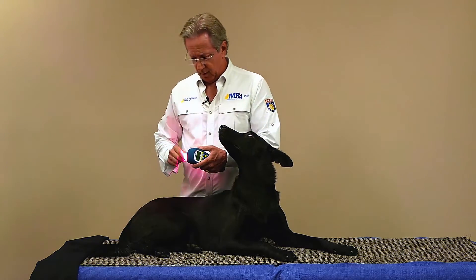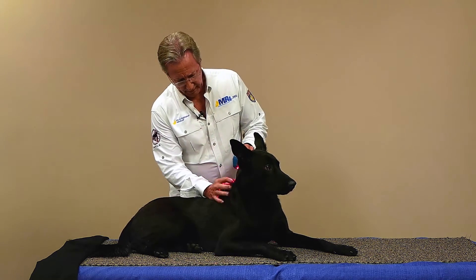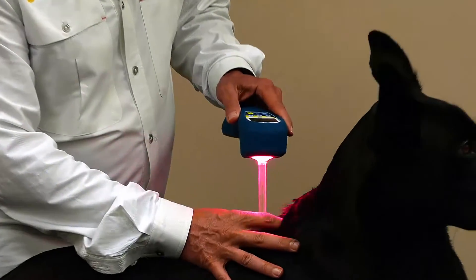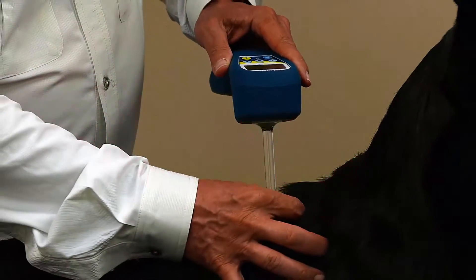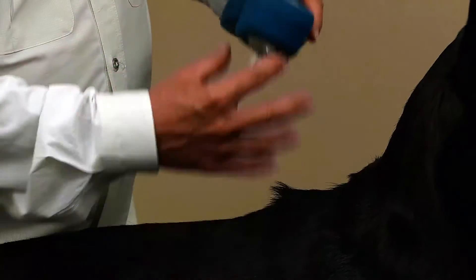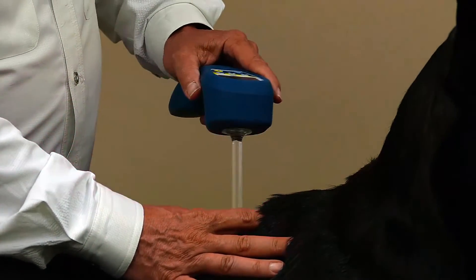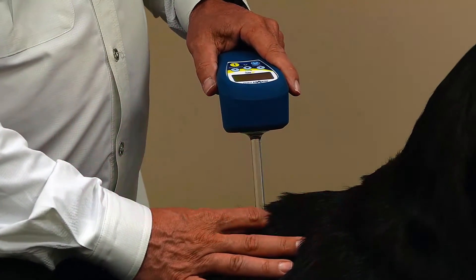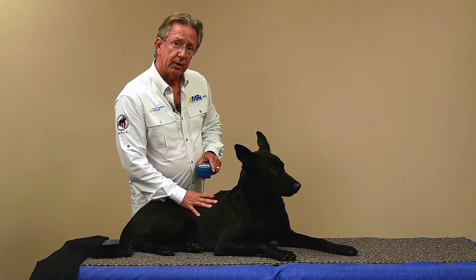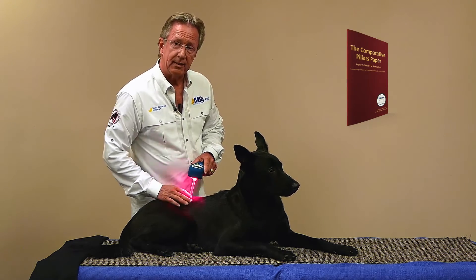But if you have a really thick-coated dog, like a Newfoundland, it's a good idea to just part the fur with your fingers so you can put this probe right down at the skin — treat here, then here, then here. This works well for thick-coated dogs or a horse in wintertime with a heavy winter coat. This is a wave guide taking that energy right down to the skin where it's doing the most good. And even with dark pigmented skin, you're never going to have a heat registration problem — we know that's a big issue with class 4. Or with a white-coated dog, it might be highly reflective. We've done research studies showing we're getting really good results and nice deep penetration with both.